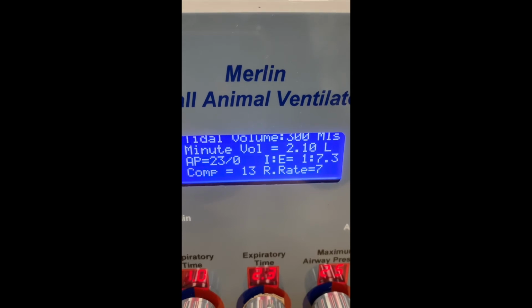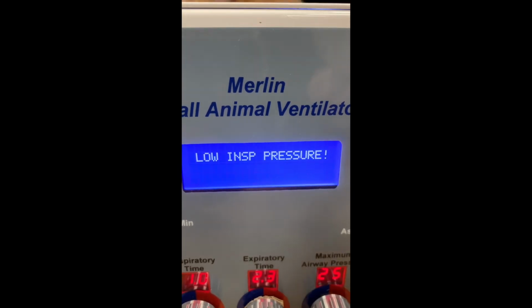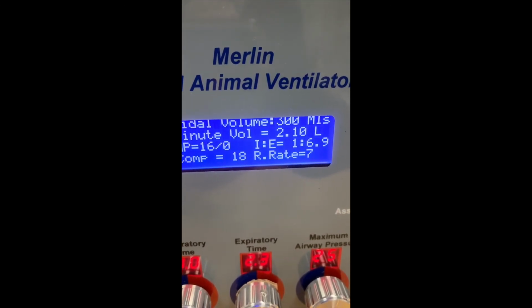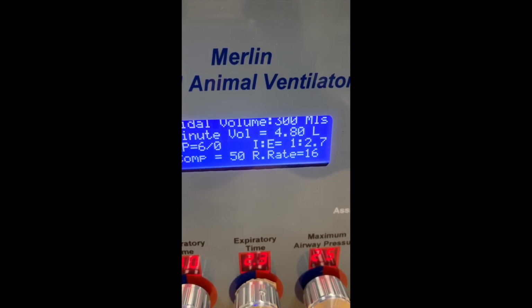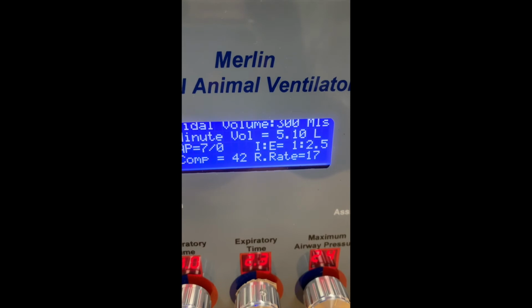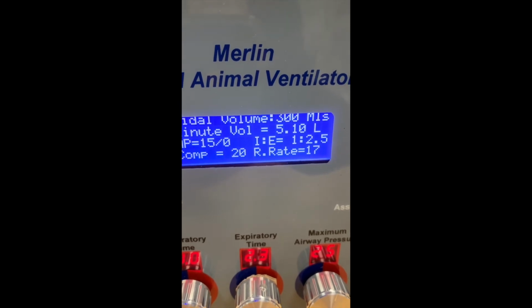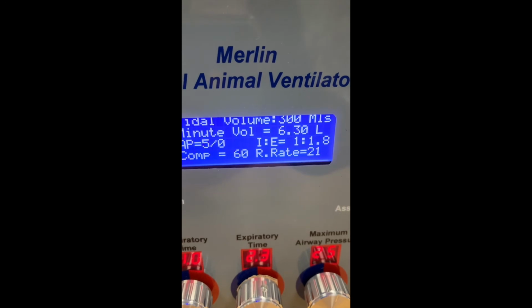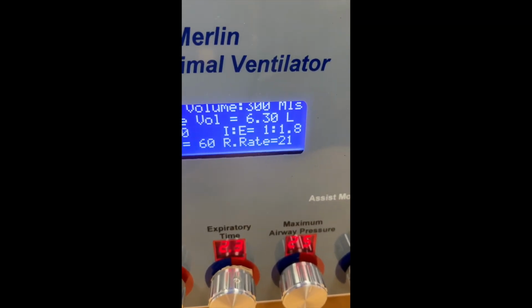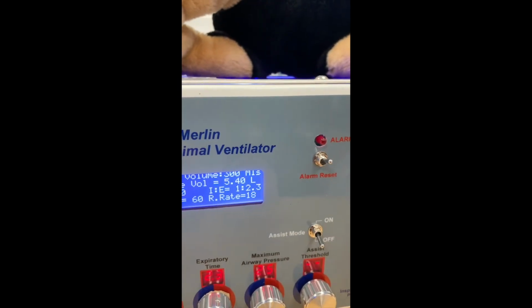The airway pressure was shown to go through -1, 2, 3 down to -7, and when it reached -8, the breath was triggered. That was a mandatory breath. And these are all triggered breaths by myself. So you can see how easy it is to go between the assist mode and non-assist mode just by changing the assist mode button to on and off.